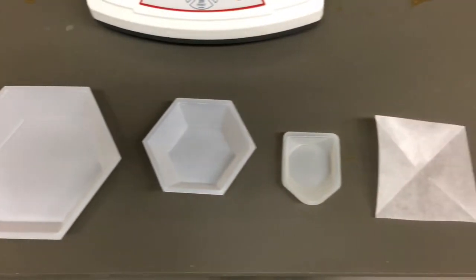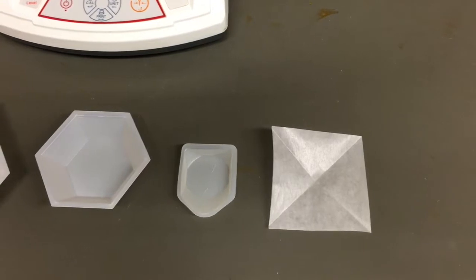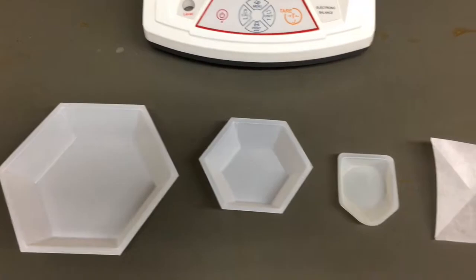Choose an appropriate weigh vessel for your media. For weighing out less than 1 gram, use a piece of creased weigh paper. Weigh boats are useful for measuring out ingredients greater than 1 gram. Do not use heavy glassware.